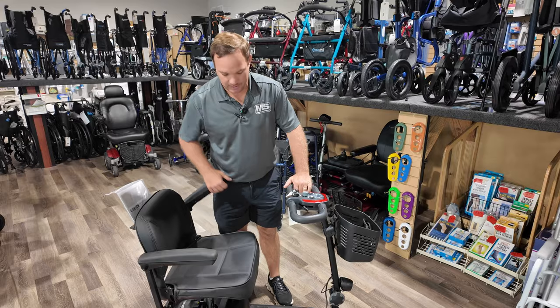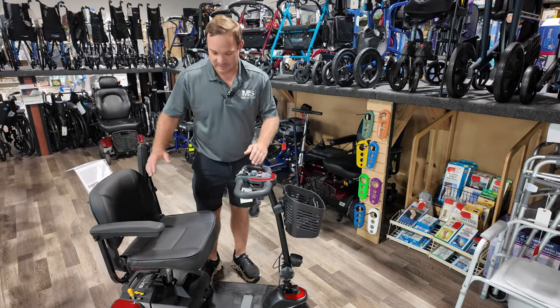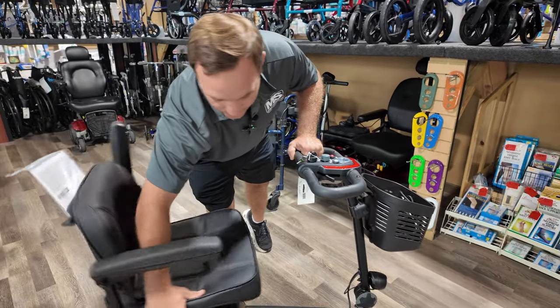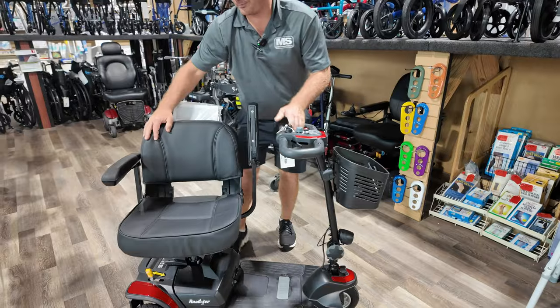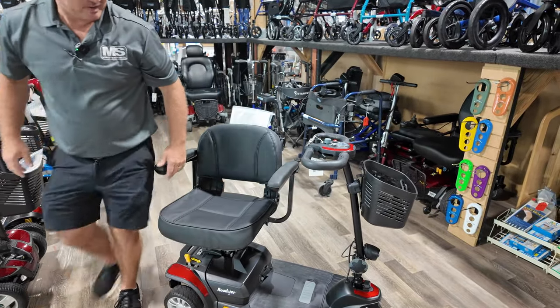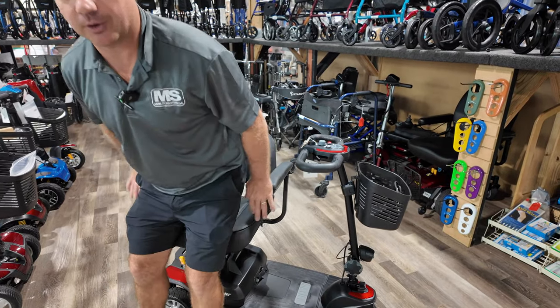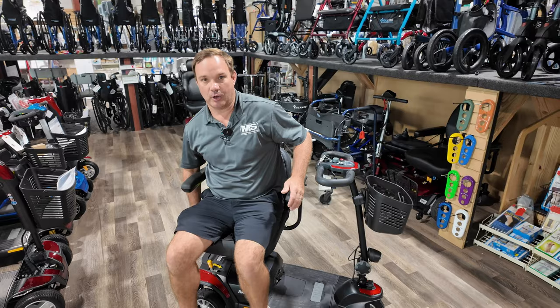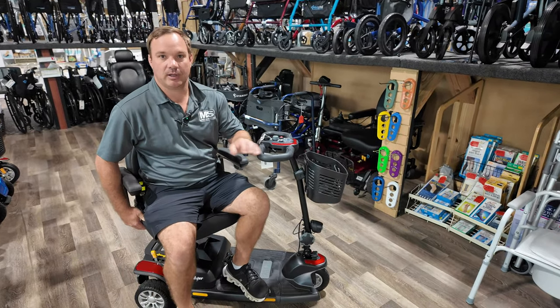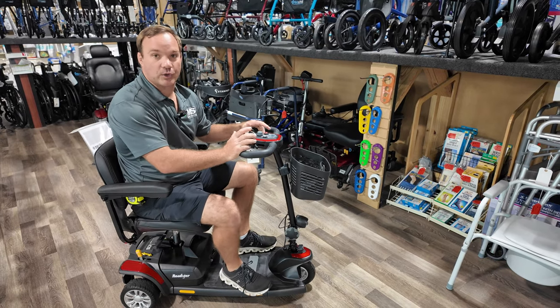A lot of people are scared of three-wheel scooters because their balance isn't that good. But if you get onto this using the swivel seat — it has a swivel seat and you can swivel all the way around — this is the best way to get on and off a three-wheel scooter. If you're buying this primarily for your yard, don't buy three-wheel. If you're buying it for shopping at stores and you know how to slow down to turn, three wheels are great.